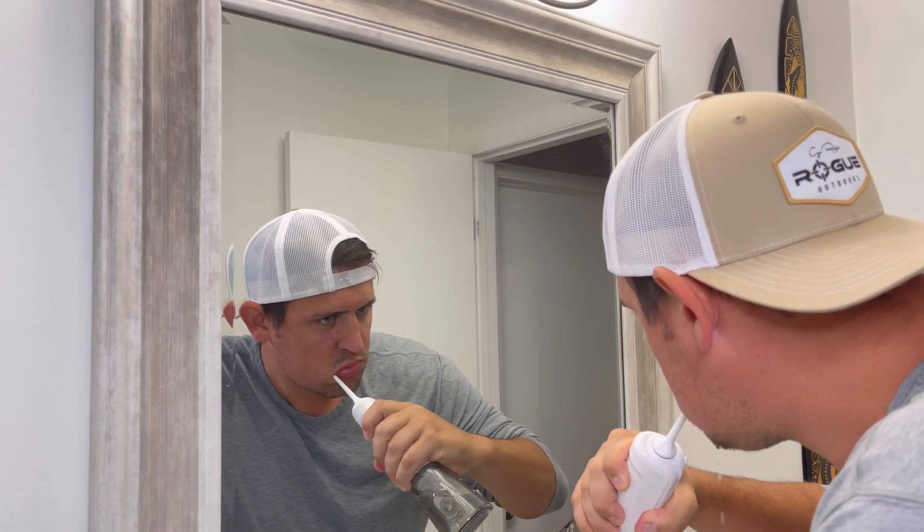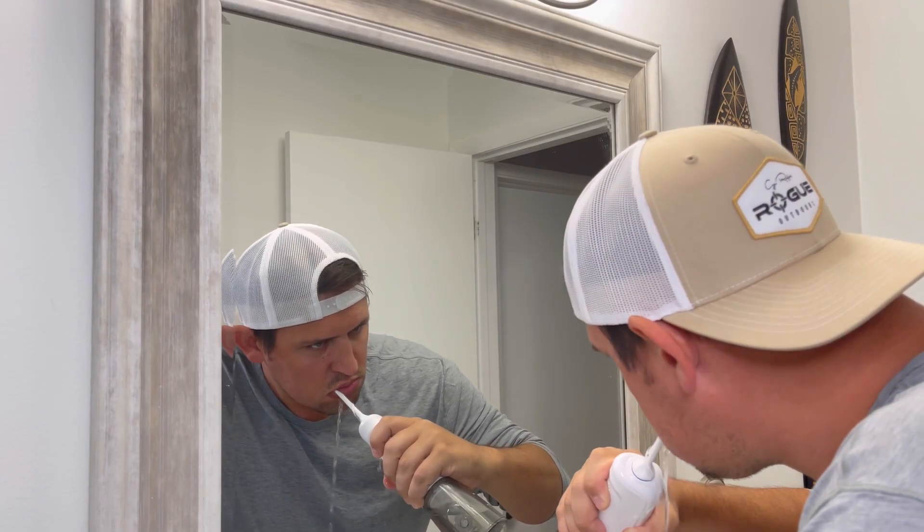I was looking for the easiest and most efficient way to floss, and I definitely found it. Thanks, B. Weiss.